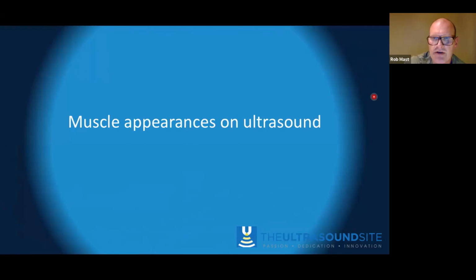So I'm just going to be talking a little bit about muscles and their appearance on ultrasound, and just talking through some of the basics around muscle injury and how ultrasound can be utilized in their assessment. Can I have the next slide, please, Stu?